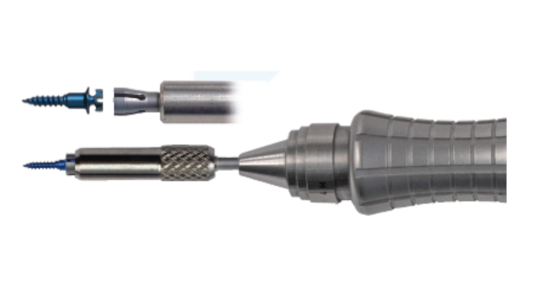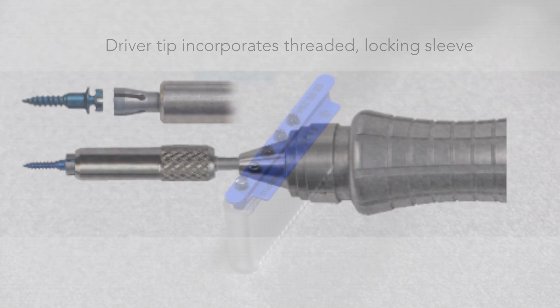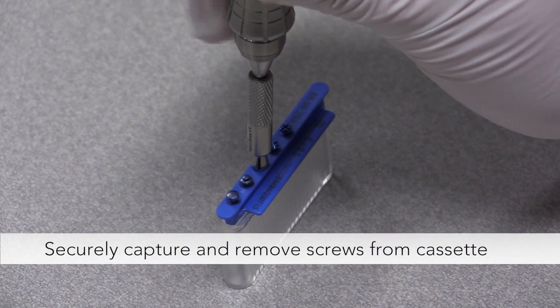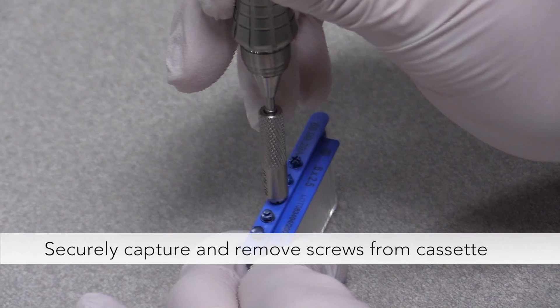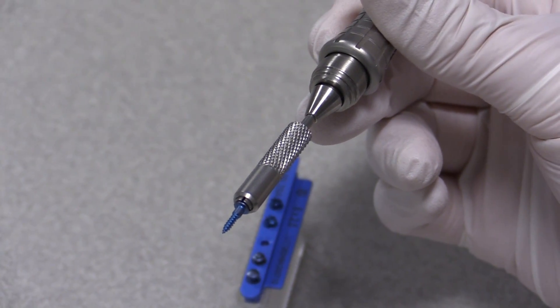The Aarhus system also features a unique driver tip which incorporates a threaded locking sleeve for engaging and picking up the screws. Advancing the sleeve to the end of the driver tip securely captures and removes the screws from their cassette. They can then be carried to the placement site without fear of screw wobble, which often compromises primary stability.